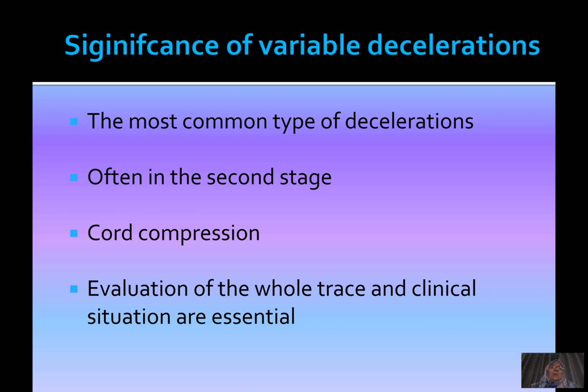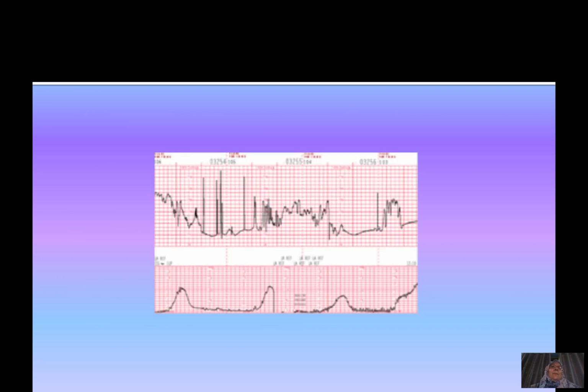However, if they continue for a long period of time, then with time, this baby will be compromised, and with time, this baby will become abnormal and need serious, urgent intervention and urgent help.